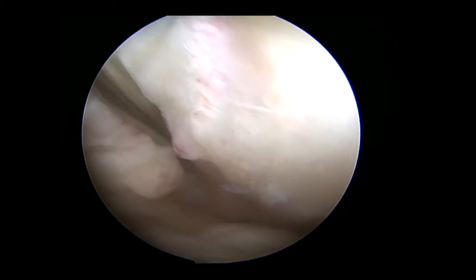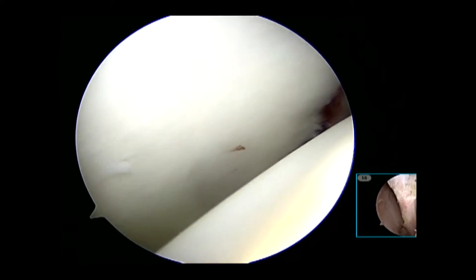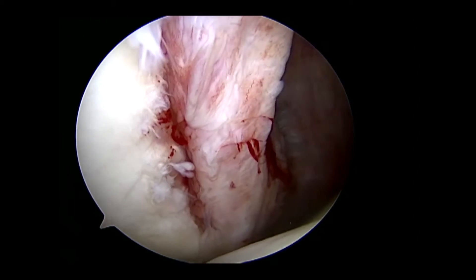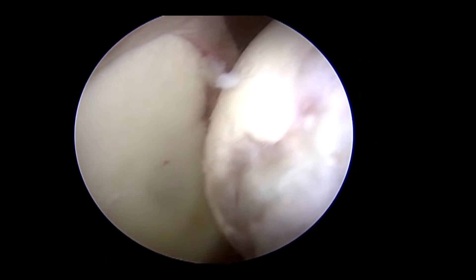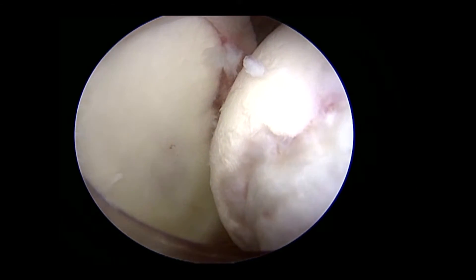A complete diagnostic arthroscopy is performed with careful examination of the posterior capsulolabral complex and the anterior humeral head, which are better evaluated with the arthroscope switched to the anterior portal. Internal rotation of the humeral head can demonstrate whether the Hill-Sax lesion engages the posterior glenoid rim.